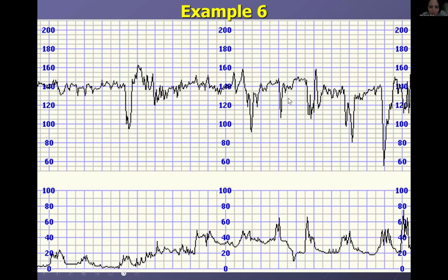On the other parts of the sheets, on the contraction side, there is a contraction. So would you count this as late? Yes, over here on your right side, these are definitely now becoming late because, for example, this one here. Even though this one also looks like it's late, it's late. This is late.